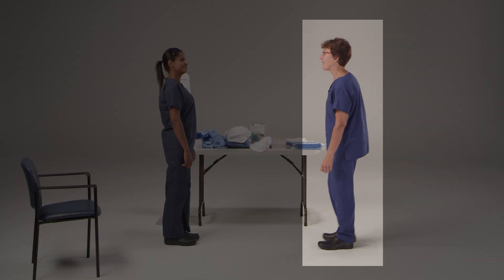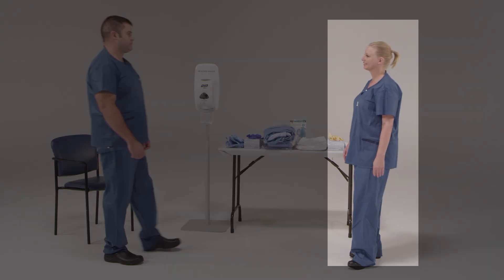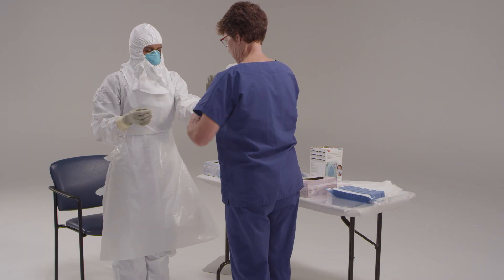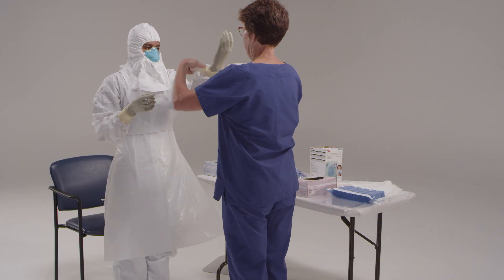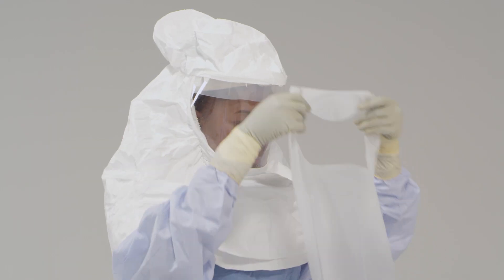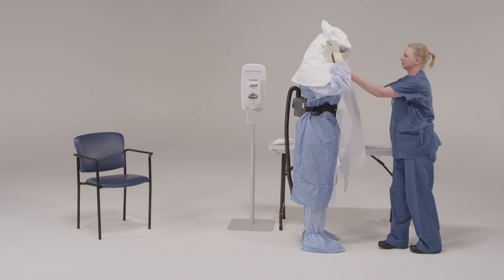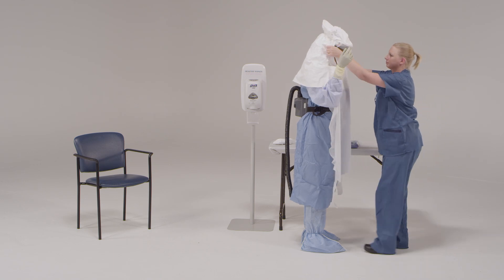The trained observer's role in the donning process has three major components. One, guide the health care provider through the donning process using the checklist. Two, assist the health care provider in donning their personal protective equipment as necessary. Three, continually scan your colleague's personal protective equipment and the environment for possible contamination risks during donning.